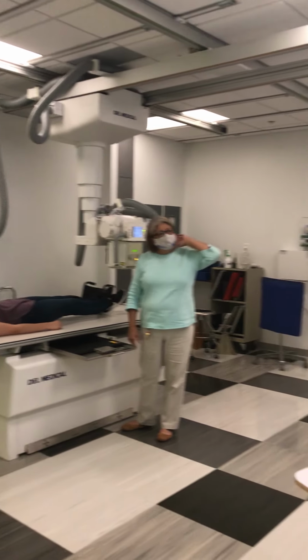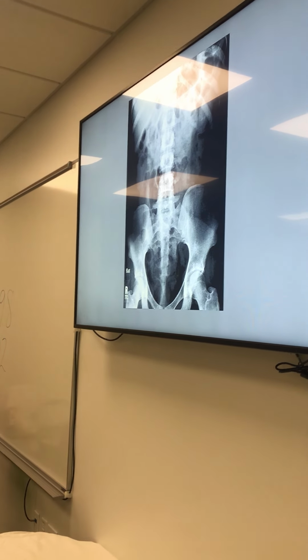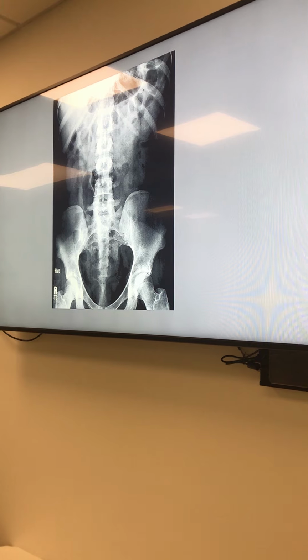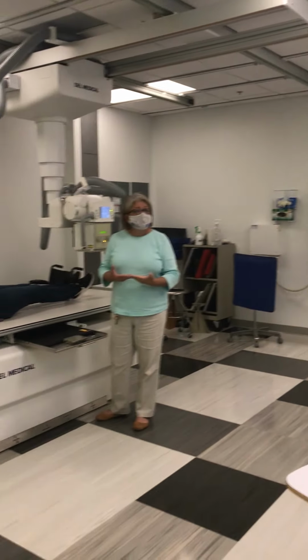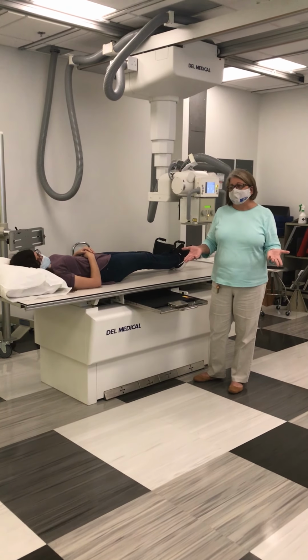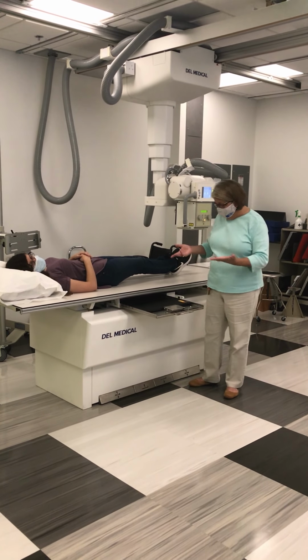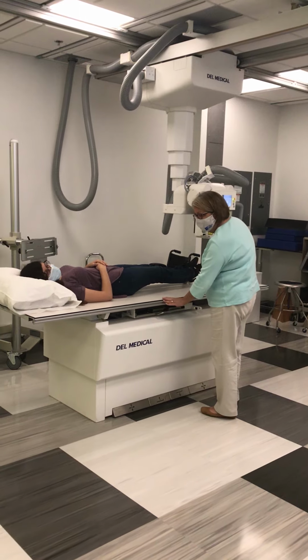If you look at the image, you'll see that marker shows up in the area of the greater trochanter of the femur. Yes, the marker is superimposing anatomy, but it's anatomy that is not of interest for an abdominal image, so that's okay. Close my bucky tray firmly.